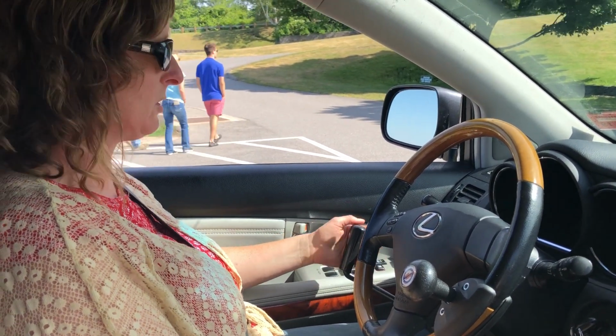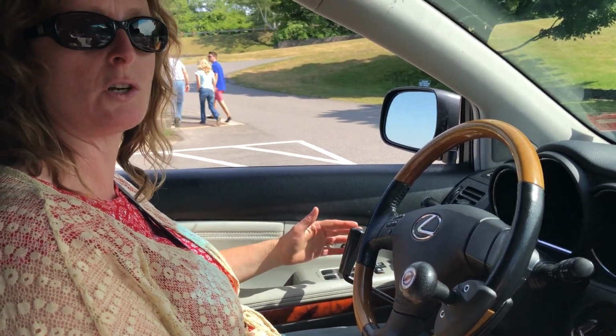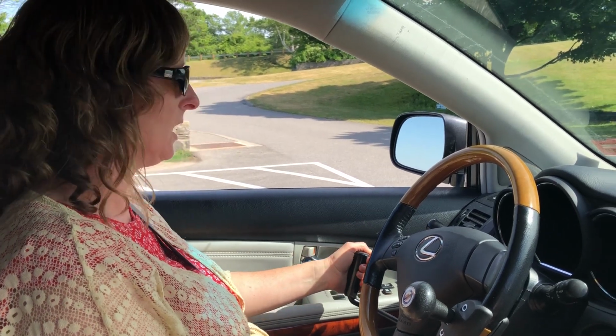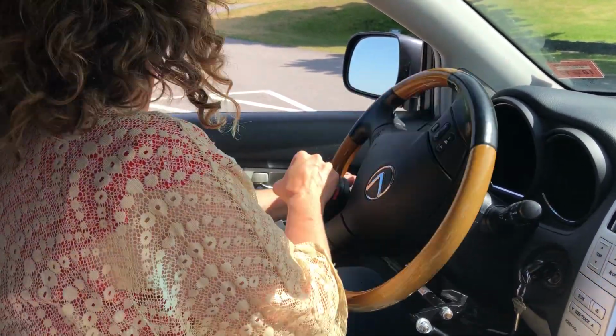to pull it down. You can use your whole hand, but you have to get used to adjusting your pressure so that you don't yank on it. All right, so let's show you how this works.